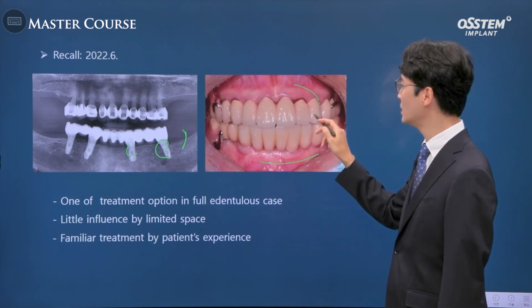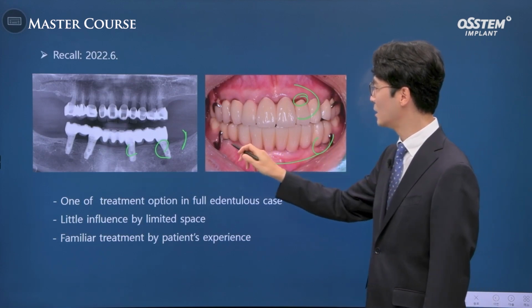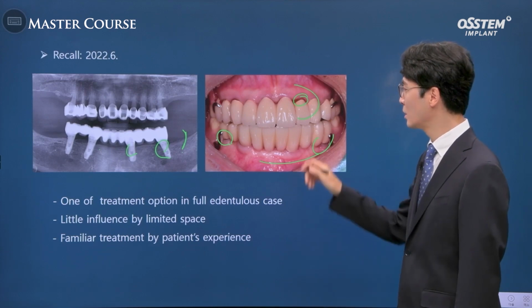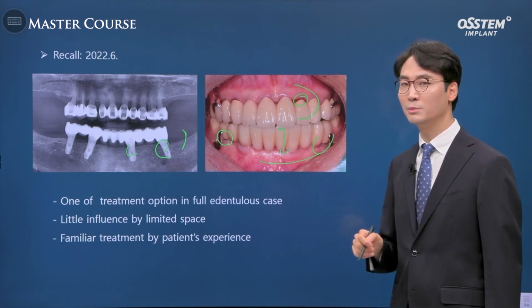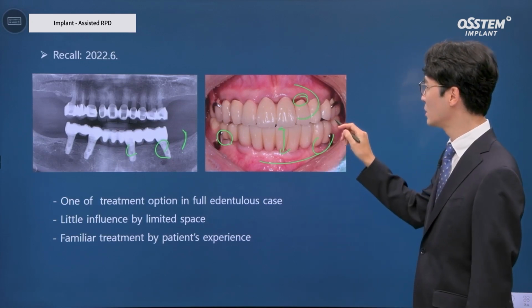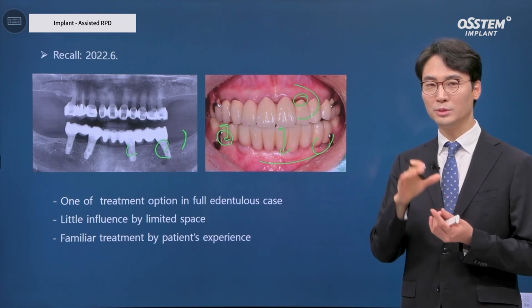After periodontal treatment, you can see that there's a slight recession in the upper, and compared to that, in the lower, despite it being 4 years, it is nicely maintained. The vertical space, I've talked about it earlier. In the case of bar over denture, it requires 14 millimeters of space, but in the case of posterior area, the space is very confined.